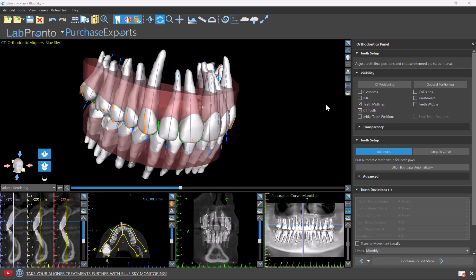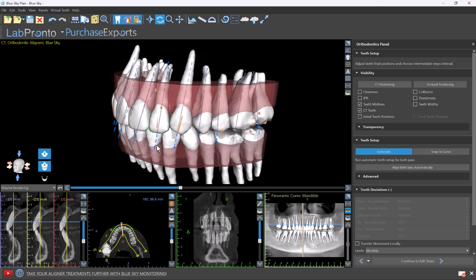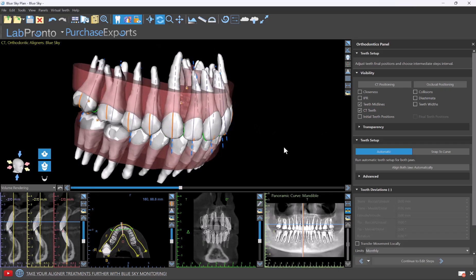I get asked all the time why they use BlueSkyPlan for your digital tooth setup for aligner manufacturing. And there really are so many different reasons. We have a direct integration with BlueSky Monitoring for remote patient monitoring. We are integrated with LabPronto to get your aligners manufactured and help with the planning if you need.